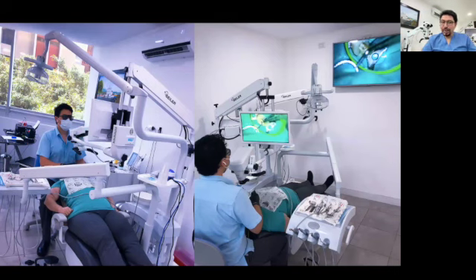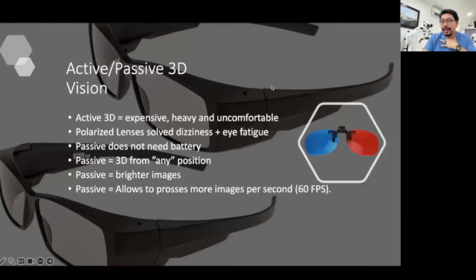And as you can see, look at the position of this patient. It is not the best position, because the patient is inclined at about 45 degrees, as this patient was experiencing some back problems. Look at my position. I still have a proper and ergonomic position, even with that angulation of the patient. Why? Because I have the screen in front of me and I was able to angulate the optical pod of the 3D microscope in the direction that I need.